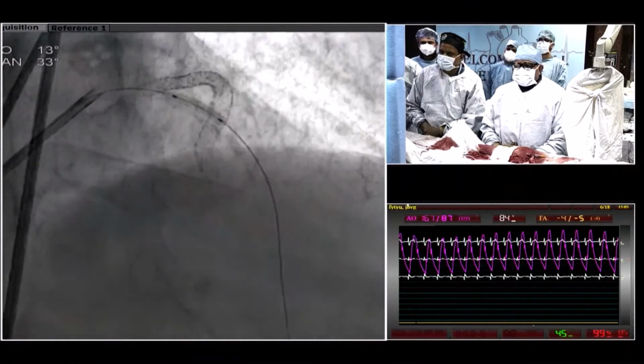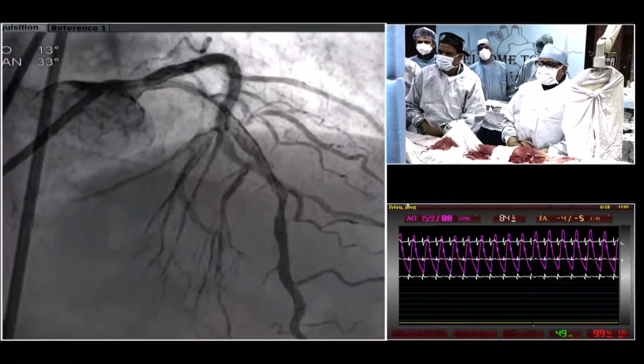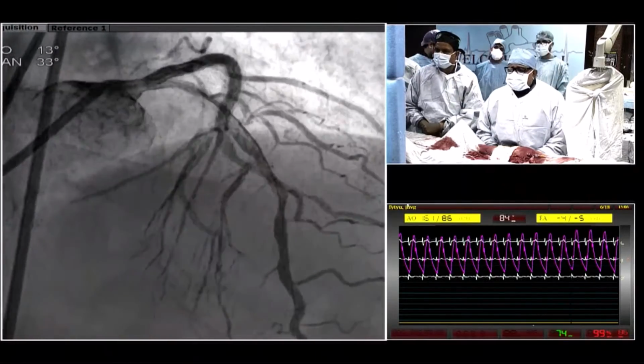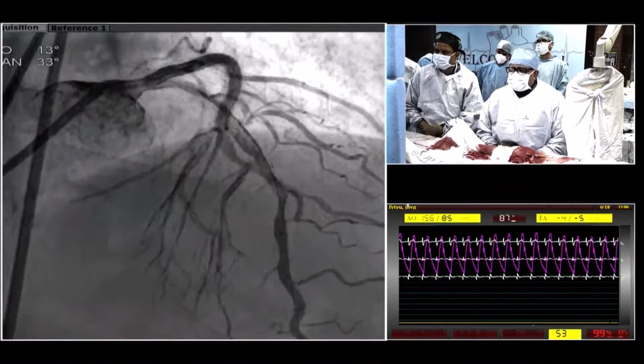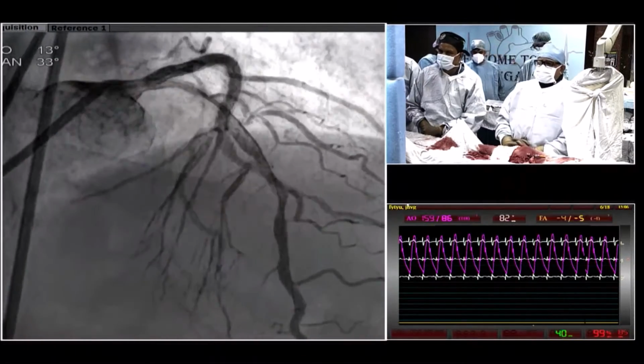Okay. Next. What is the size of your artery on OCT, media to media? So artery size is 3 millimeter distally and 3.5 proximally. Okay, so at this ectatic segment, at this dissected segment in the mid part, it's 3.5. And distally it's 3 millimeter.